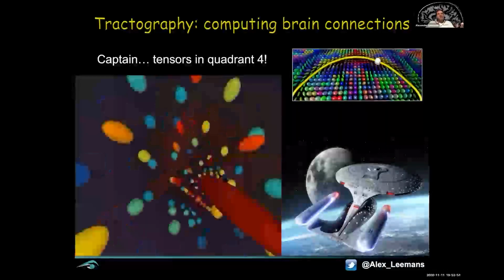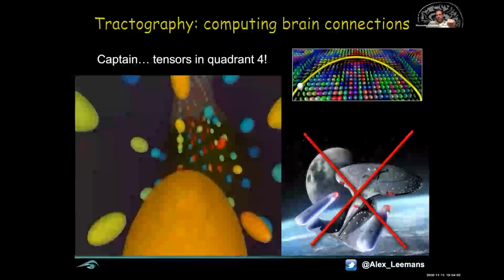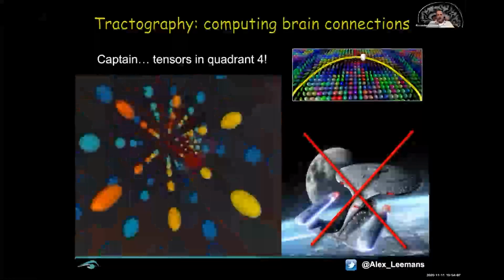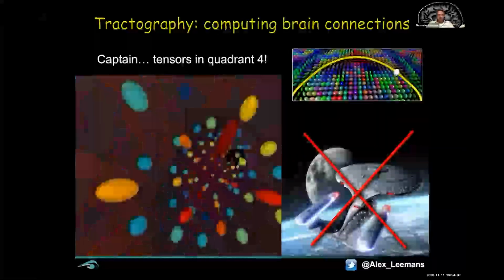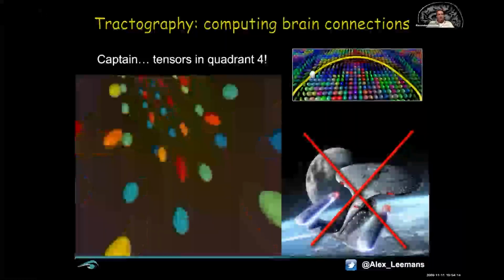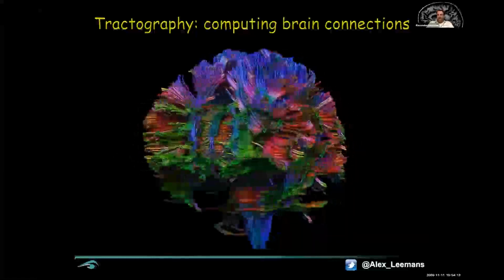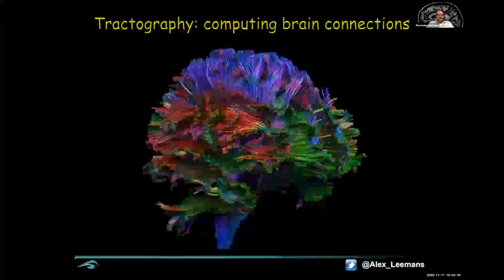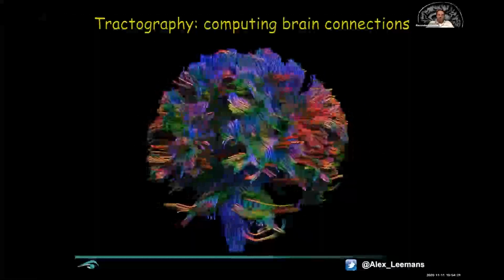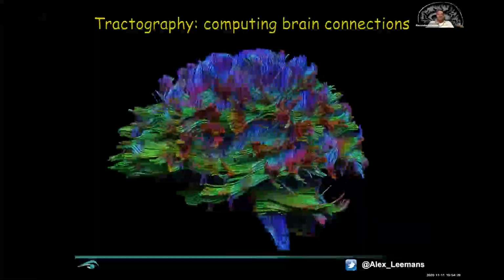Okay, so this is just to give you an idea of how these pathways are propagating through this diffusion tensor field, right? So at each point, the pathway is looking like, okay, what turn should I take? What pathway should I follow? And this can be done now on multiple data sets, on multiple seed points. And then you end up with these colorful spaghetti-like structures, which we would call a connectome. It's basically the entire set of connections between the different brain regions.